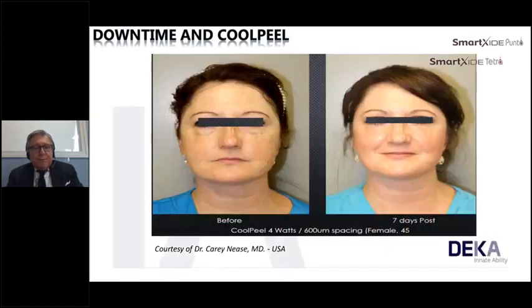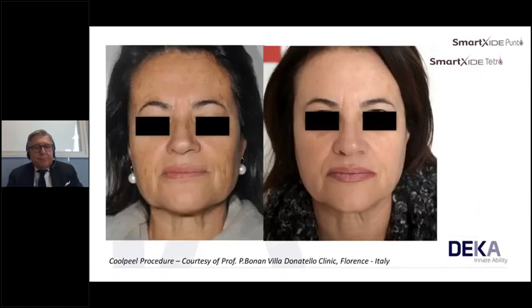What is interesting is that after the treatment, this is our patient, it's not dramatic, but it's definitely some damaged skin where we have some dyschromia, some vertical lines, some crepey skin, hyperpigmentations and some laxity.